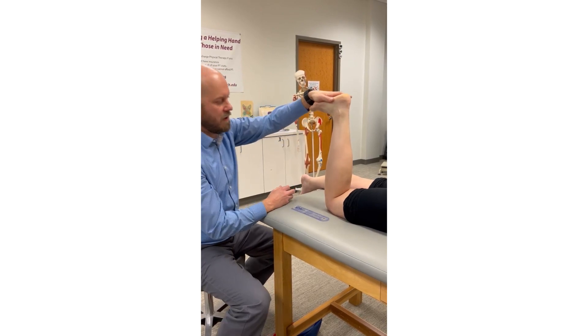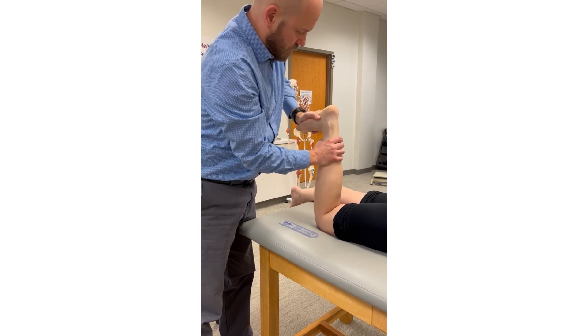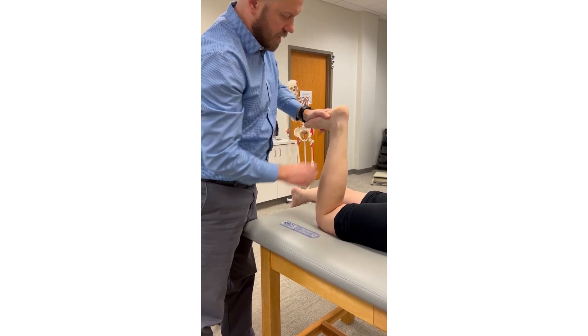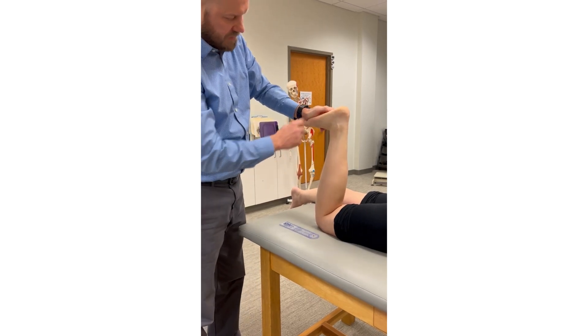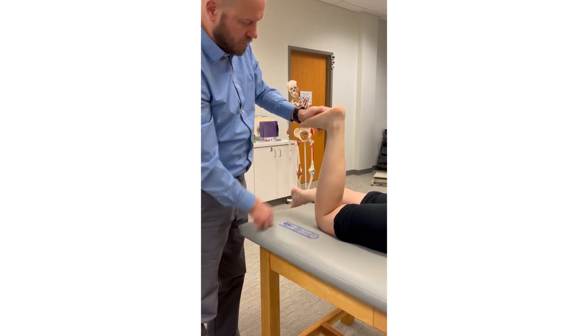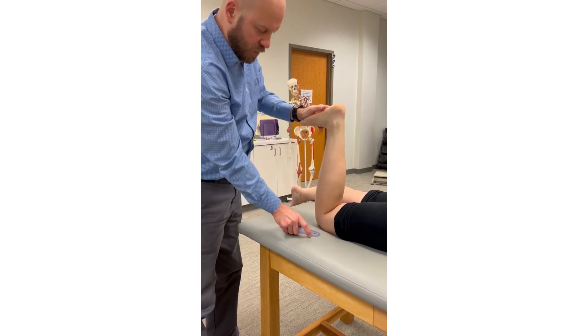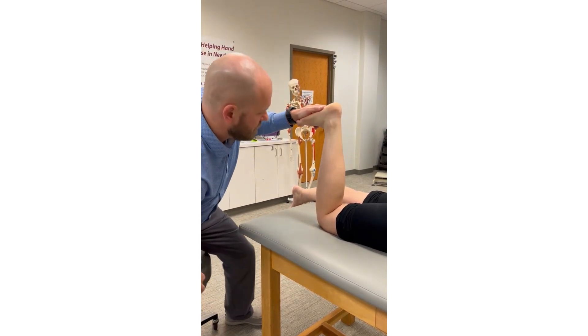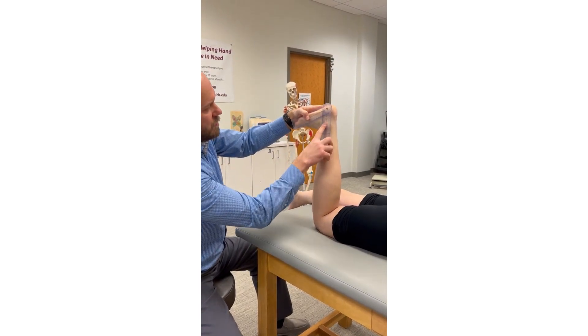In this position we can apply overpressure, spring against the barrier, and assess end feel. We can also take an estimate so we have a rough idea of what our measurement instrument should read. Then, while maintaining overpressure and holding that end-range position, we can line up our goniometer.